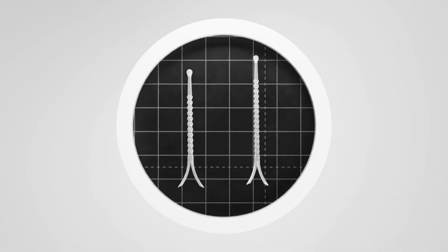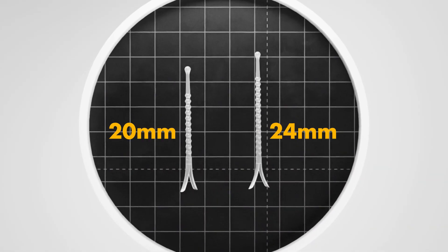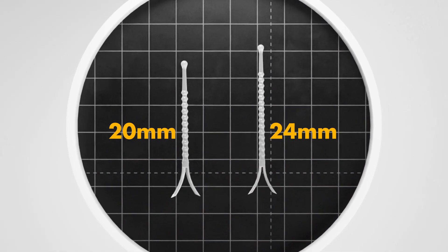Select the Latera implant size — 20 mm or 24 mm — based on patient anatomy.